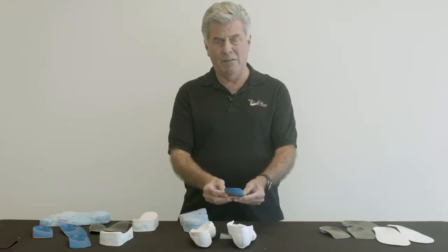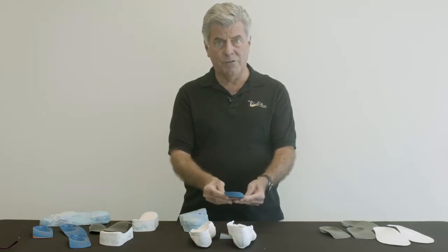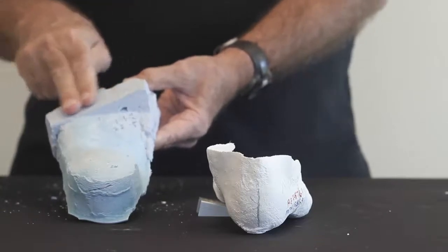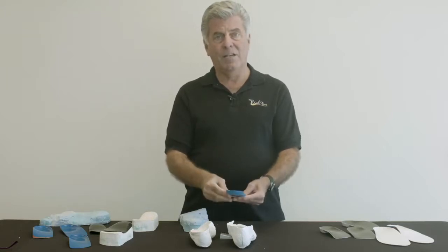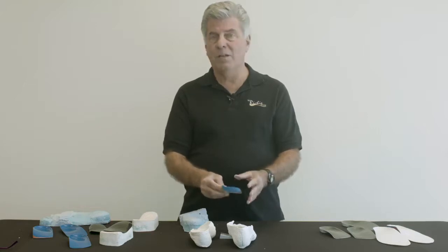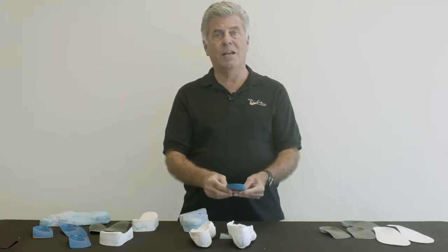A better way, in many cases, to correct the alignment of the foot orthoses is to have the orthoses balanced with an intrinsic post. The concept of adding an intrinsic post or balancing a foot orthoses intrinsically is a somewhat complicated topic, and I'm going to take a few minutes to try to explain this to you in a simple manner.